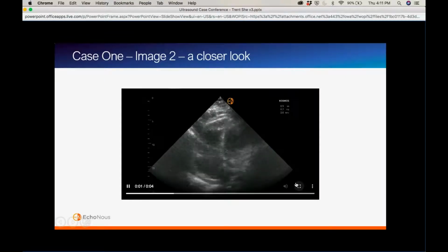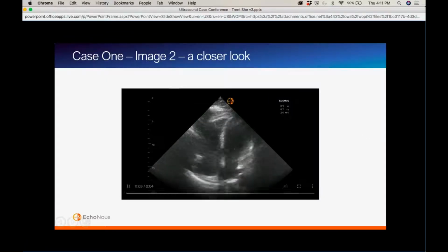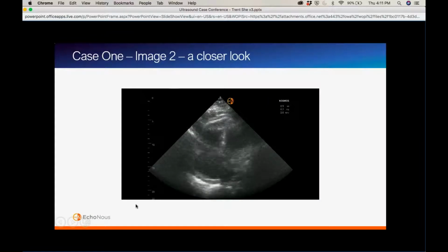The first thing I think when I get an odd finding like that is, really? So I actually go back and re-ultrasound the patient, and I'm trying to convince myself that that little area in the apical portion of the right ventricle is her right ventricle thrombus. So our hypothesis was she had this RV thrombus that obstructed the outflow of her blood from the right ventricle. And we were like, well, this potentially could be the cause for RV dilation and potentially her shortness of breath. So it's probably the most proximal version of a pulmonary embolism that you can have.